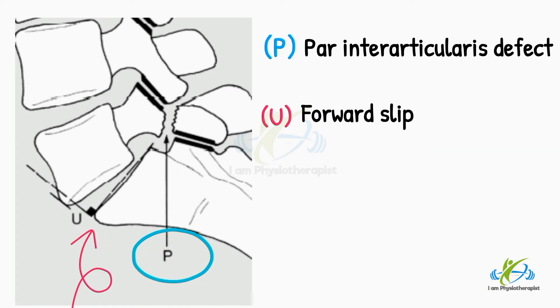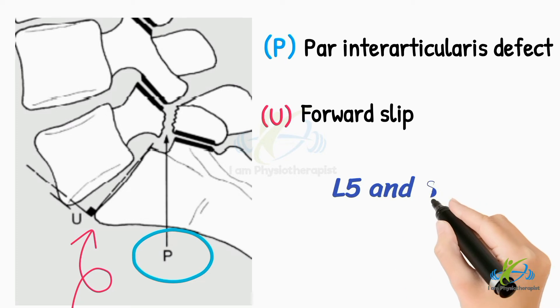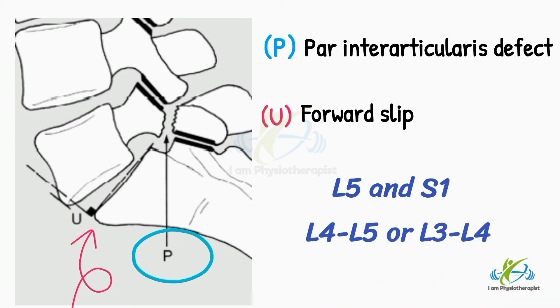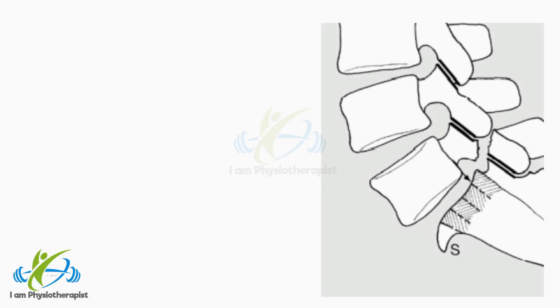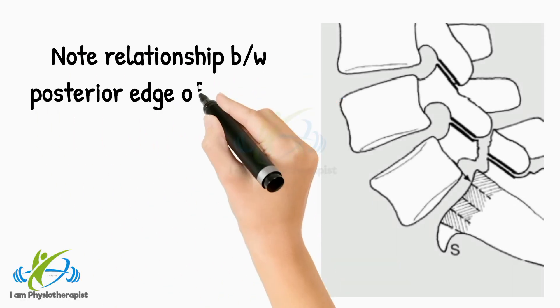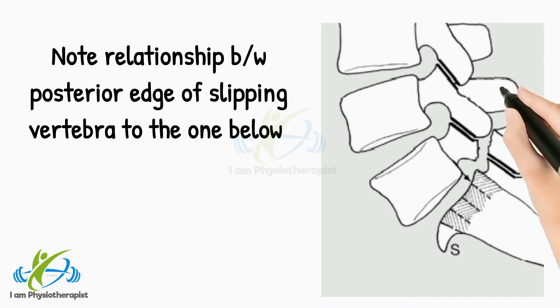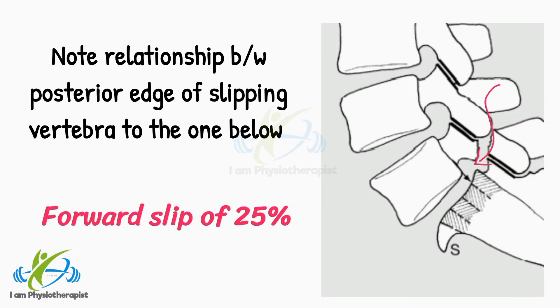The deformity may occur between L5 and S1, and much less frequently between L4-L5 or L3-L4. Note the relationship between the posterior edge of the slipping vertebra to the one below. The example shows a forward slip of 25%.